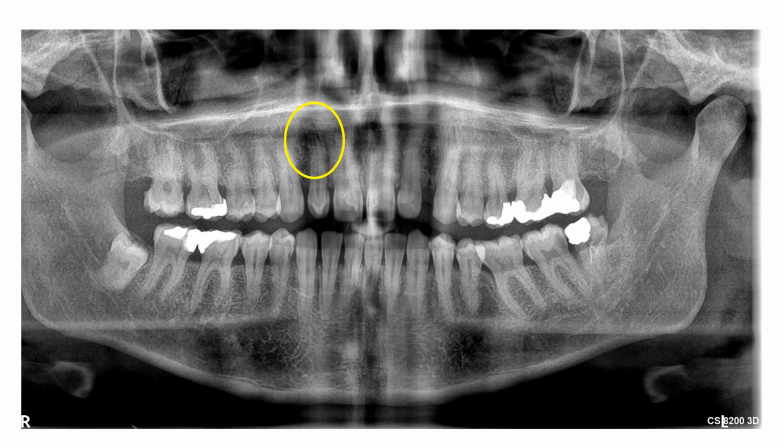Of course, I found what looked more like a dens invaginatus in the tooth. So really, I was skeptical about whether this radiolucency is a lesion or what, because I've got another lesion here and here and here.